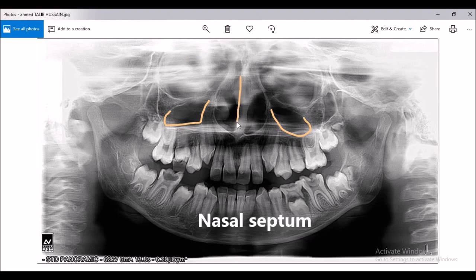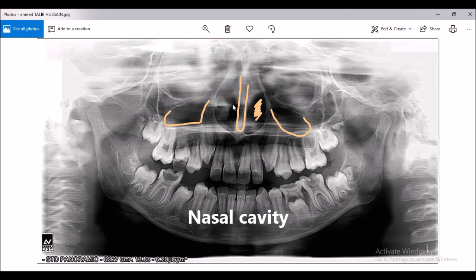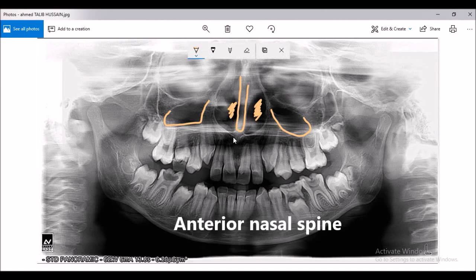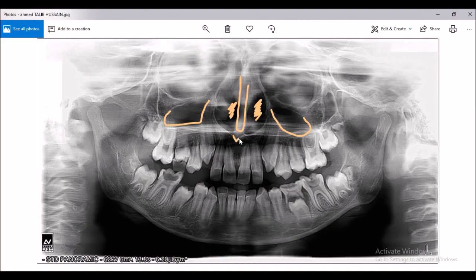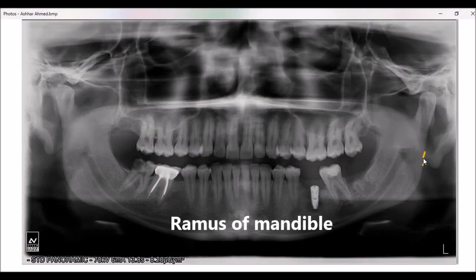This space is the nasal septum. This space is the nasal cavity. And this pointed area, this spine, is the anterior nasal spine. This portion is the ramus of the mandible.